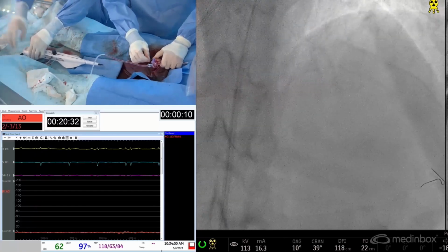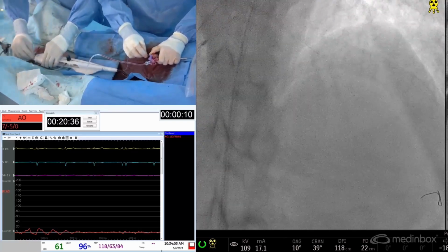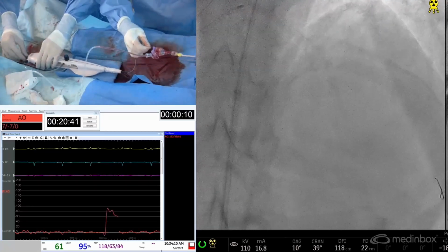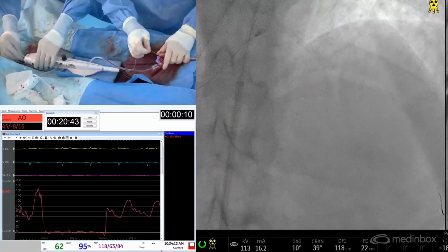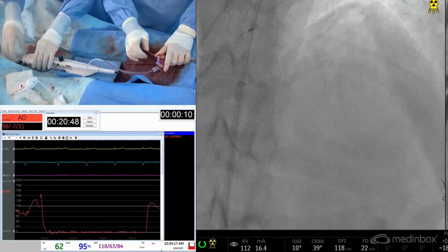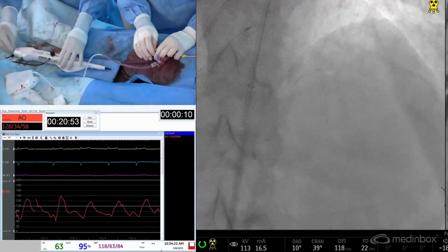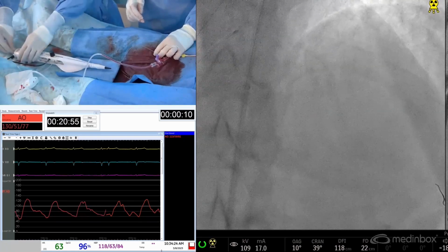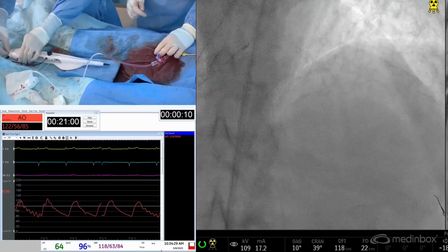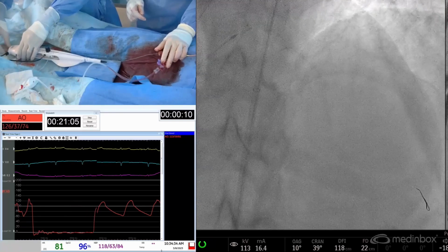We're starting with 1.5. I find that 1.5 stalls less. Sometimes we have to ablate a bit going in. The wire is, I think, too advanced distally. We could pull back just a little bit so we don't get any perforation. Release the brake. It's even tougher to pull back, so I think we better start with this and then exchange it out afterwards.